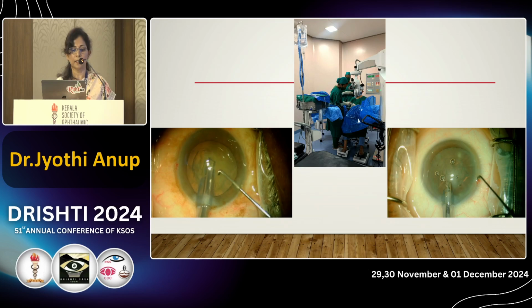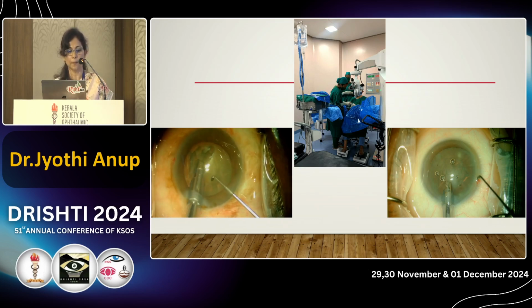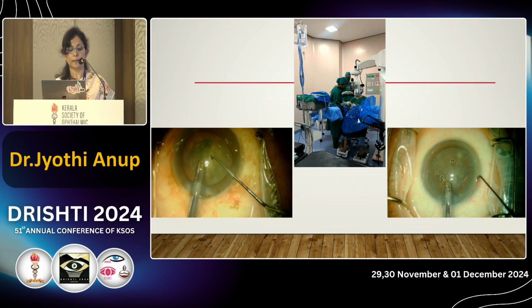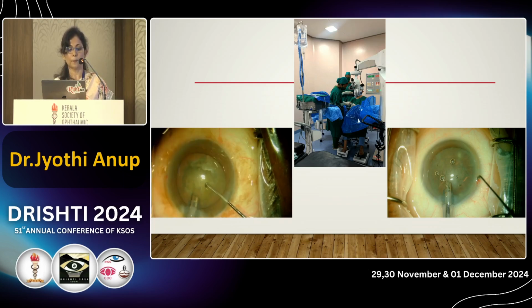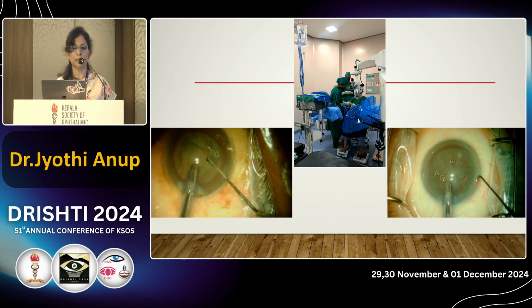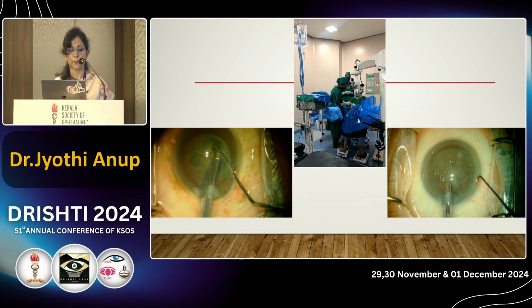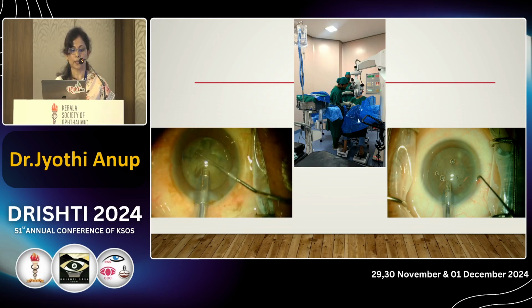And this is the technique for a beginner phaco surgeon, divide and conquer, where you have to sculpt and make 2 trenches. You have to go deep, widen the trench as you go deep. You should not push the nucleus while trenching, and make 2 trenches, one perpendicular to each other, to make a cruciate groove. Till this you are doing in a phaco machine setting with less vacuum. And to crack, you have to keep your probe at the base of the trench so that you get a very good crack.